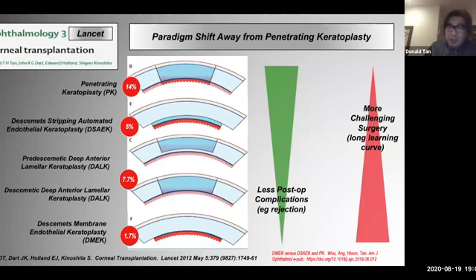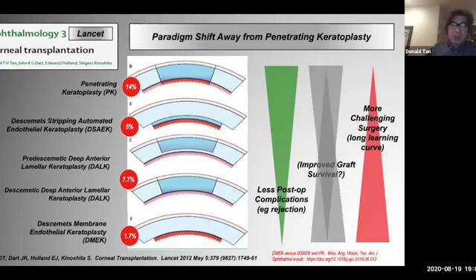The challenge with this is that surgery is more difficult. And obviously, if there are surgical challenges and problems, then it's not only a long learning curve, but your initial graft failure rates and immediate post-op complications are higher. So the balance is really whether we have improved graft survival rates. And I've shown in previous talks the studies from, say, the Australian corneal graft registry, which actually shows that lamellar surgery can have worse outcomes, really because of the surgical challenge, not the physiology of performing lamellar surgery.